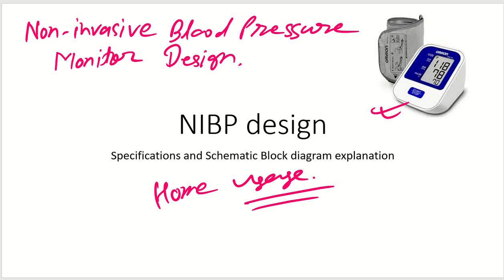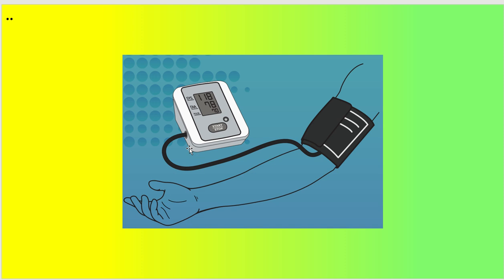Okay. So actually it looks like this. There will be a cuff that is connected on the hand of the person, and it goes to the pump, right? So this pump tries to fill the air, which is connected through a valve, an air valve.